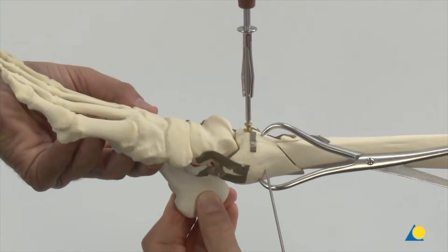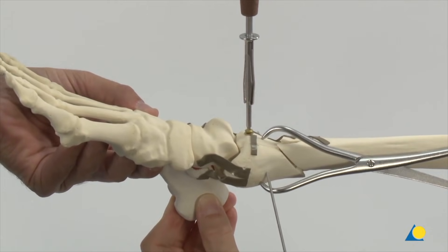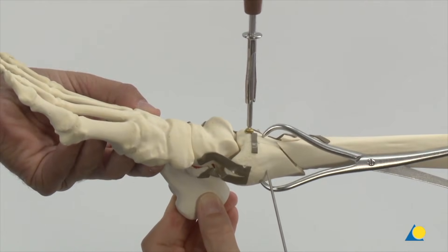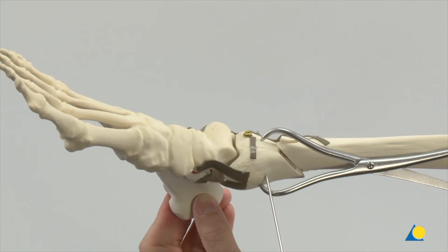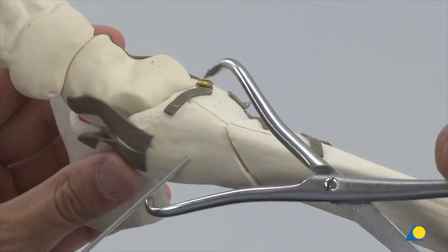After drilling the glide and thread holes, a cortex screw with washer is inserted as a lag screw, and the fragment is fixed through interfragmentary compression. As an alternative to the cortex screw, a 4 mm partially threaded cancellous screw can be used. The reduction forceps and K wire are removed.